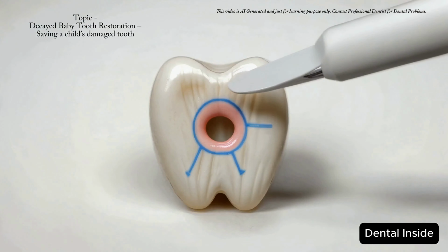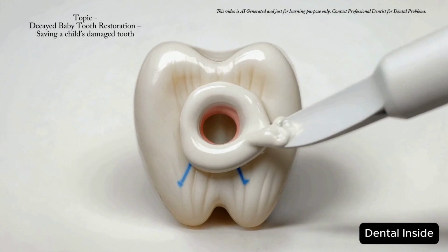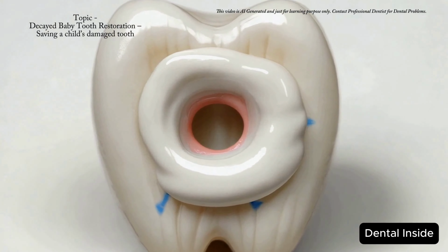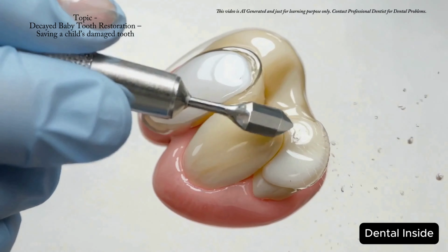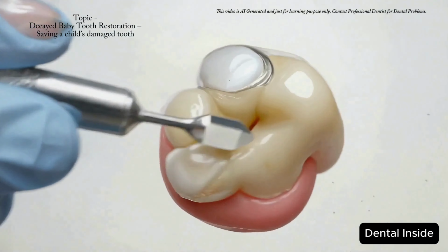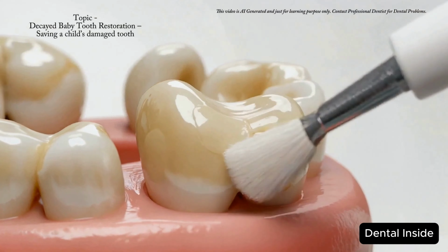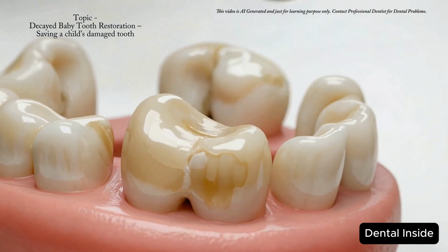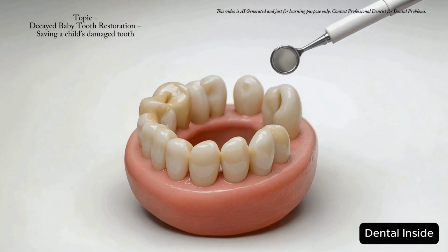An appropriate restorative material may then be placed to rebuild the prepared area and restore the tooth form. The restoration is carefully shaped to recreate an appropriate contour and functional surface for the primary tooth. The restored tooth is carefully finished and checked to evaluate its shape and the completed professional restoration.